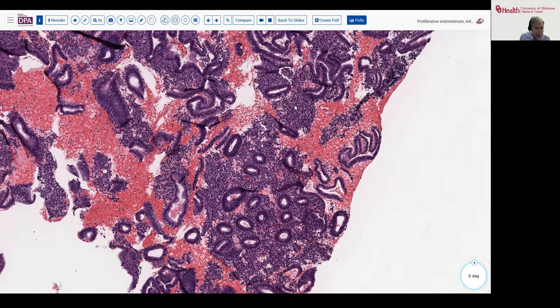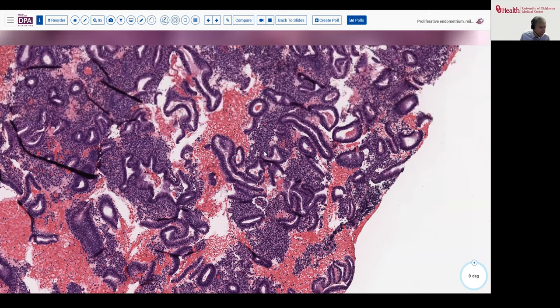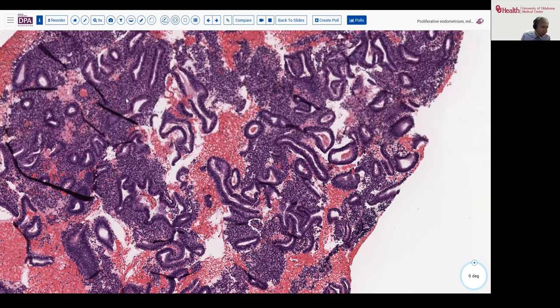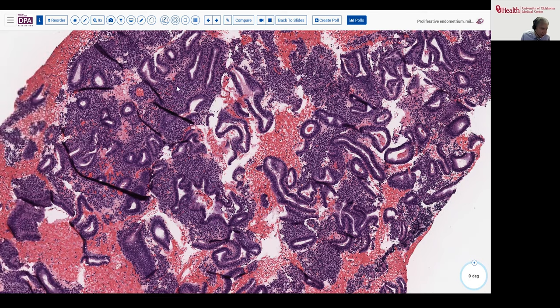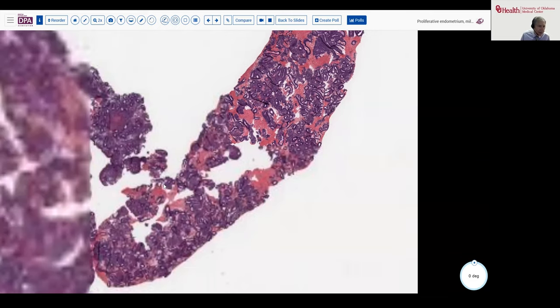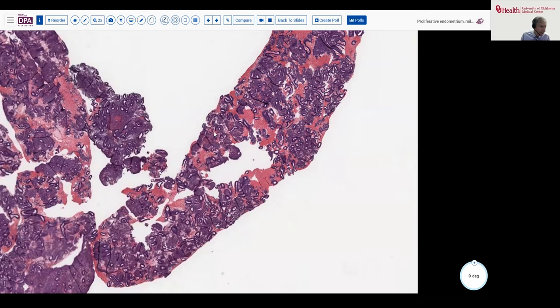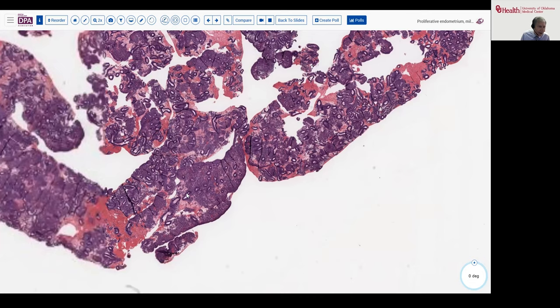Once you begin to see subnuclear vacuolization, you should begin to think about secretory phases. Looking at this biopsy sample, there were a few glands where you could find a little clearing beneath the nuclei, suggestive of an early secretory phase change. It's not very prominent here, so I still classify this as proliferative phase endometrium. Those are the key features I look for. We'll see similar changes when we look at disordered proliferative endometria and compare them to this more routine, normal proliferative endometrium.